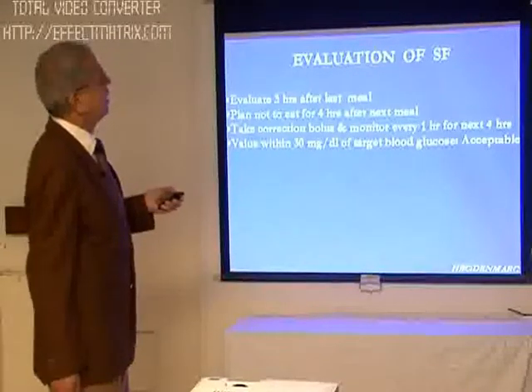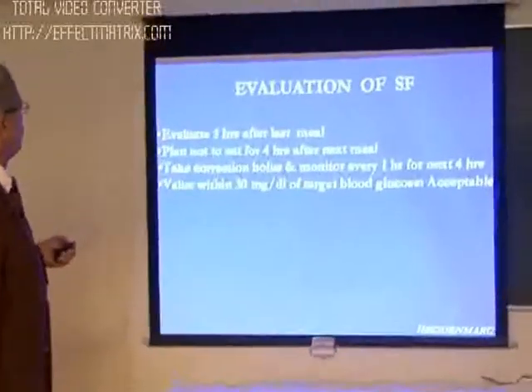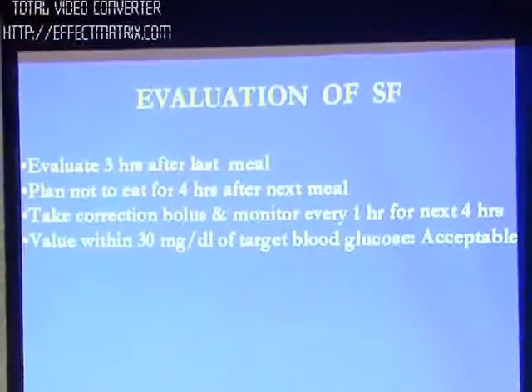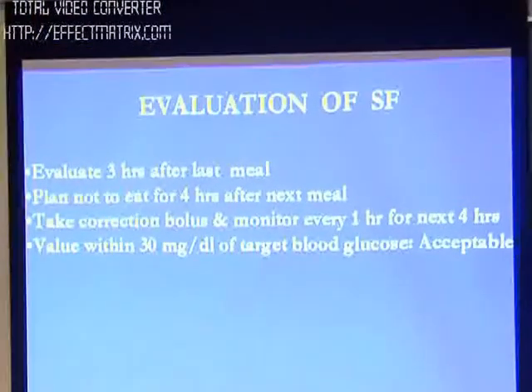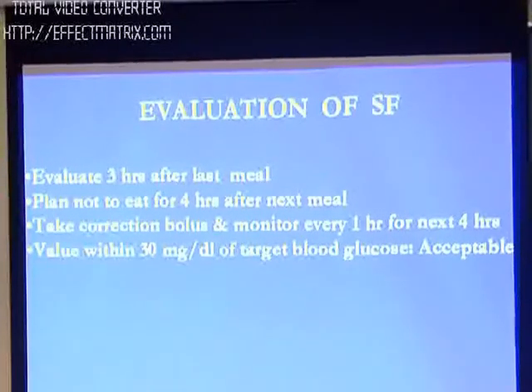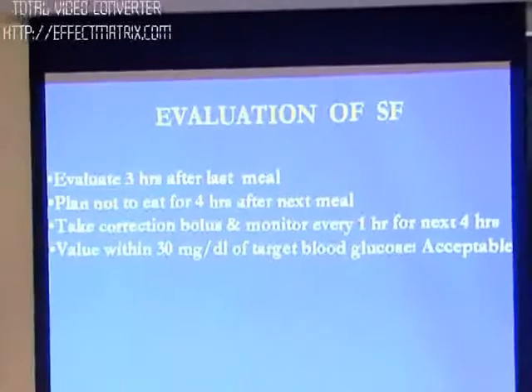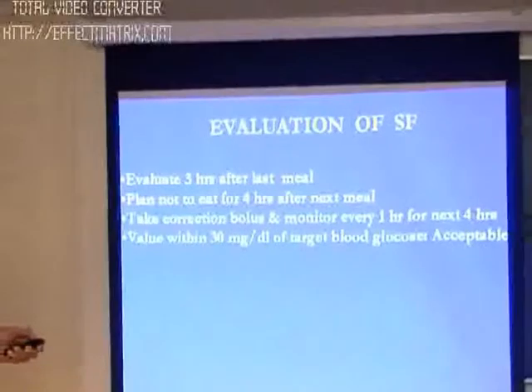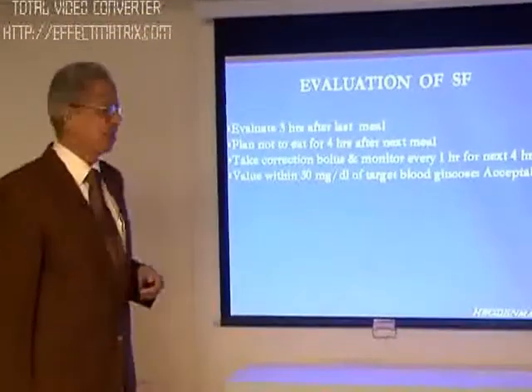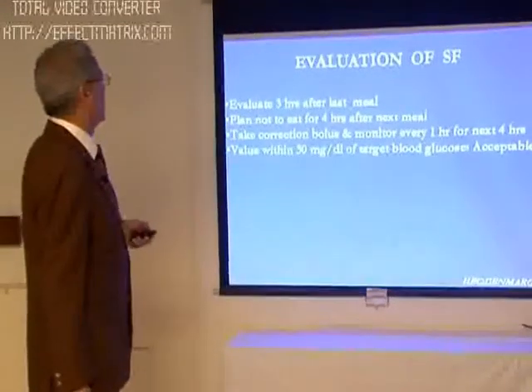Now, how do you evaluate your sensitivity factor? You usually evaluate it 3 hours after the last meal, and patients should not eat for 4 hours after the next meal. The patient can take a correction bolus and monitor every 1 hour for the next 4 hours. This is how you evaluate sensitivity. So you start with some calculations, but you evaluate it by doing this procedure once in a while.